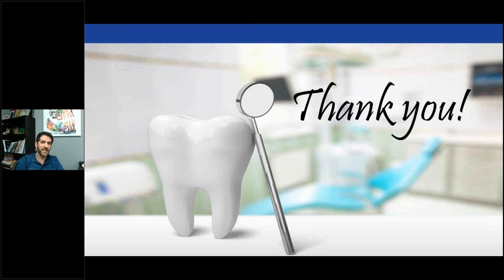And then let your ceramist stain them and tell them, this was sintered for a high translucency zirconia, and this was sintered for just a solid zirconia. So the high translucency, you want to give it more characterization, and the solid zirconia, you want to basically just stain it, because you want customers to know the difference, and you want to know the difference. And after we did that, we saw the results, and we're like, we don't need 3 different zirconias. We can use 1 zirconia and just stain it differently and sinter it differently. So if you have 1 sintering oven, you can run a night program and a day program, or if you have 2, you just divide them into 2 different ovens every night, and then you have the high translucency and the regular solid zirconia. But that's basically what made us make that change and choice.